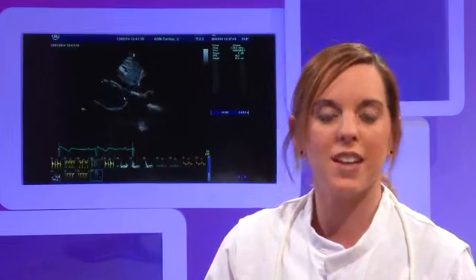So this is how we can assess a mechanical prosthesis in mitral position. In that case, you can clearly see the normal movement of both leaflets. You can see that there was no significant leakage and also no indirect sign of leakage. And also you can note that there was a mean gradient of 3, which is strictly normal, and a mitral valve area of 1.5, which is concordant with the reference value in the literature.